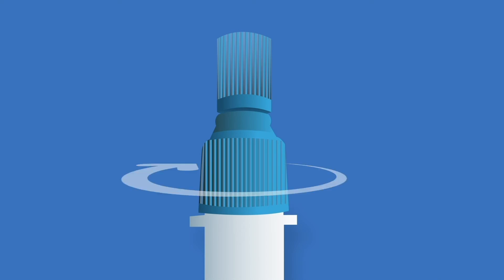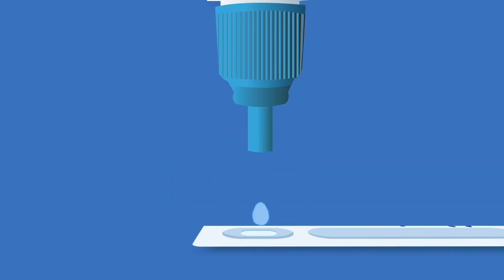Screw the blue cap back onto the vial, then unscrew the transparent cap and pour three drops into the sample well of the test cassette.